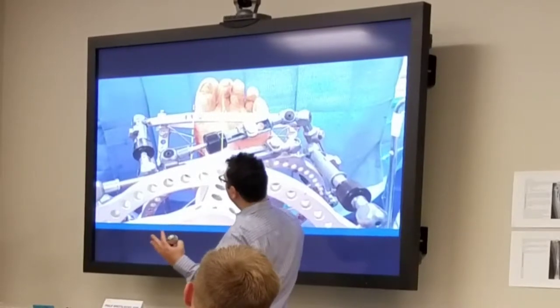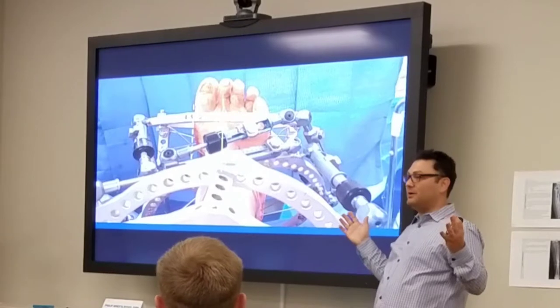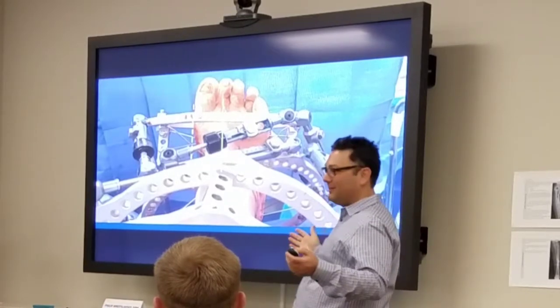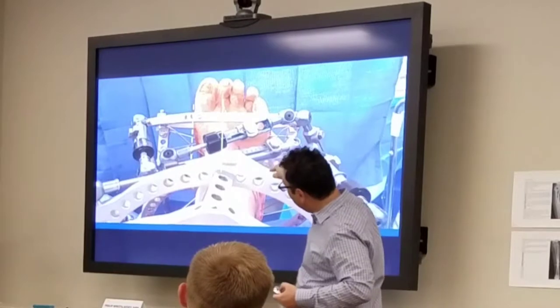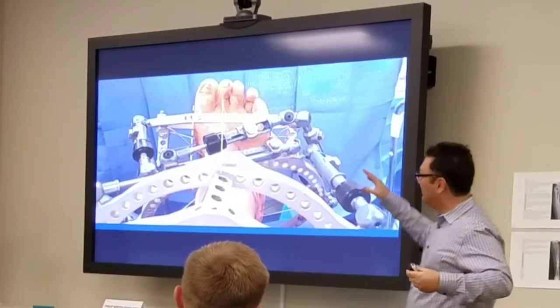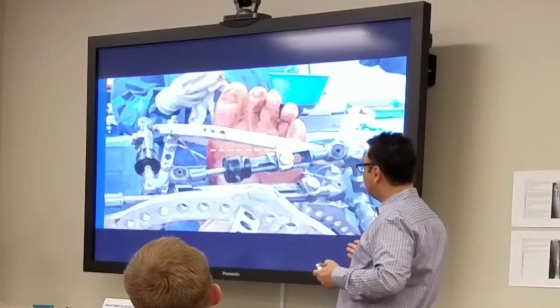By raise of hands, is this translated medially or laterally? Medially, anybody? Is it translated laterally? Anybody? All right, nobody wants to guess. It's medial. This is easy to do once you look down the frame properly. When the surgeon asks, how do I know if it's medial? You just got to stick your head on top of it. These pictures can help you see where it is.